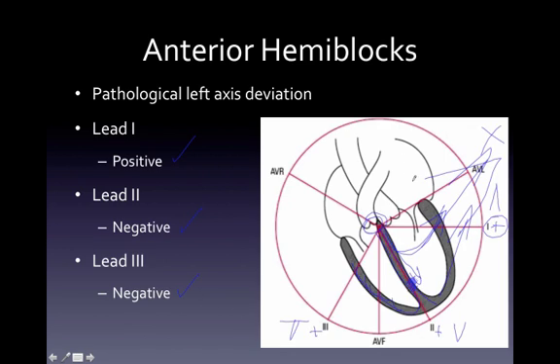If you will please remember that anywhere from negative 30 degrees to negative 90 degrees is our numbers. The machine comes up with a nice EKG assessment of where it thinks that the axis is. So we always pay attention to that, but it's always good to double check the machine's work. And that would be if we had the limb leads on there incorrectly.